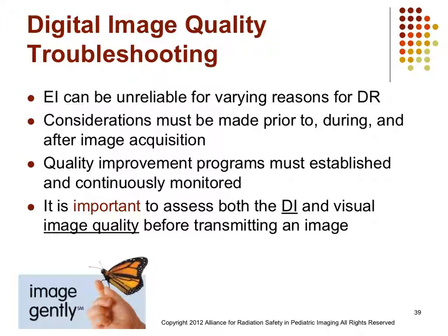So certainly making sure that we incorporate the IEC deviation index as part of our standard routine, evaluating that, holding ourselves accountable, or perhaps a quality manager holding yourself accountable to make sure that those are done on a routine basis.